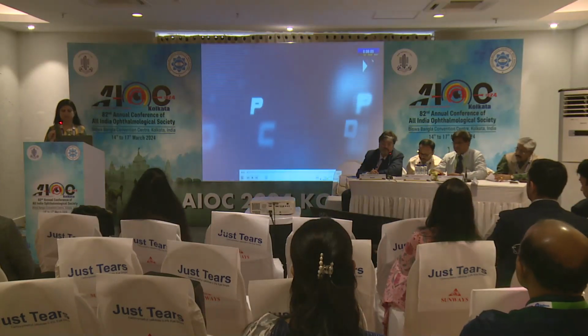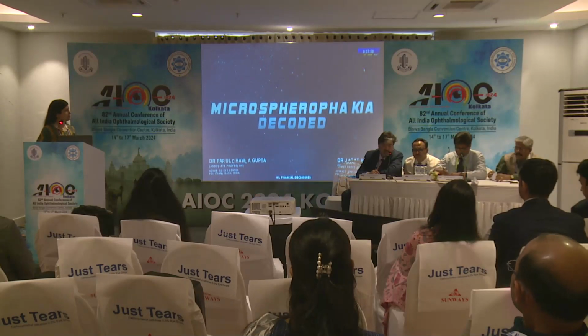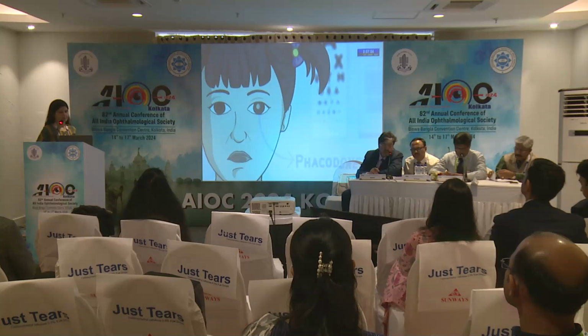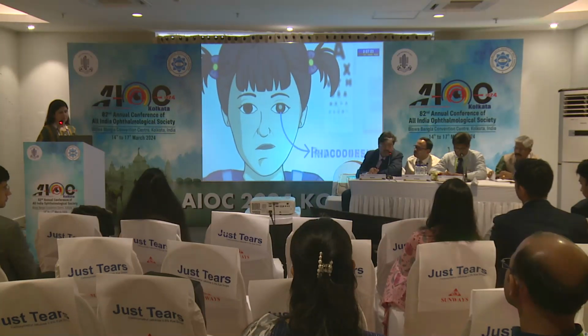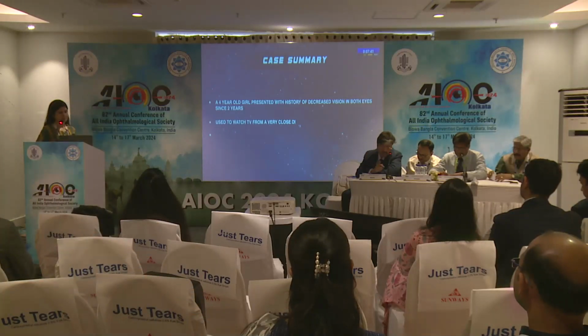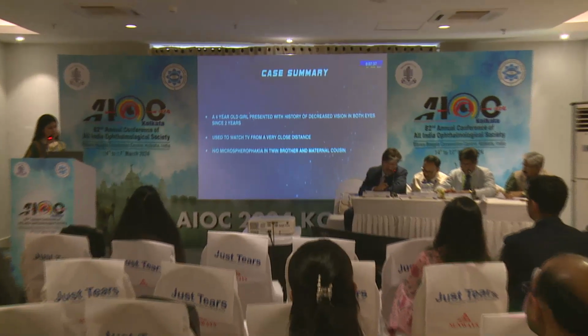This video demonstrates the surgeon's technique to manage a case of microspherophakia with profound zonular weakness. This is a case of homocystinuria presenting with microspherophakia. A 4-year-old girl presented with history of decreased vision in both eyes since 2 years. She used to watch television from a very close distance. There was history of microspherophakia in the twin brother and maternal cousin.